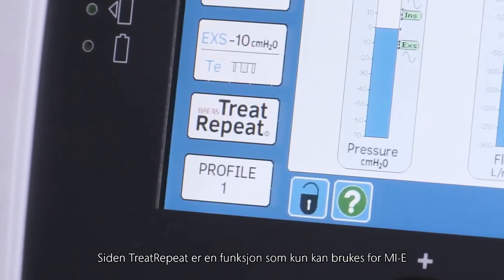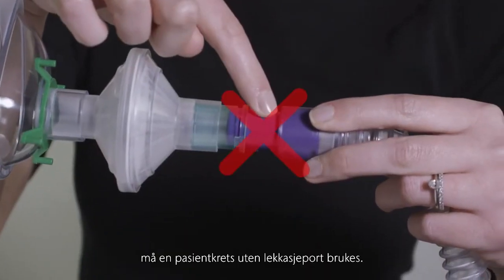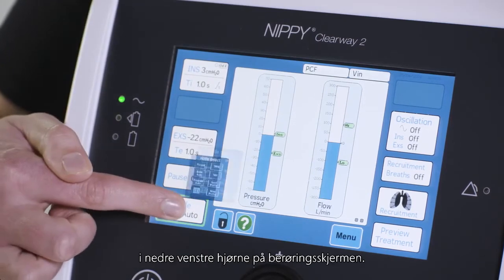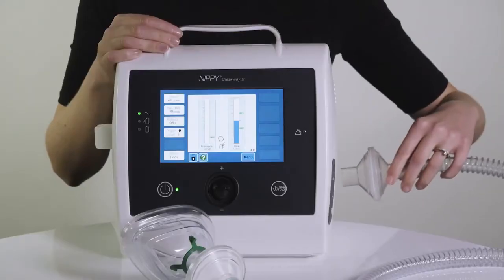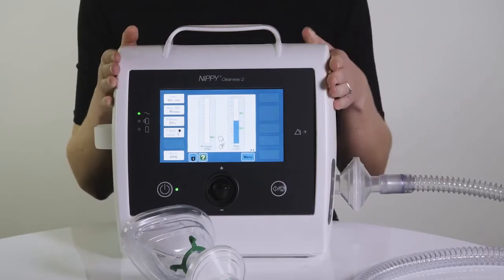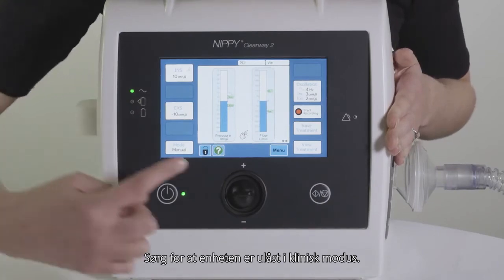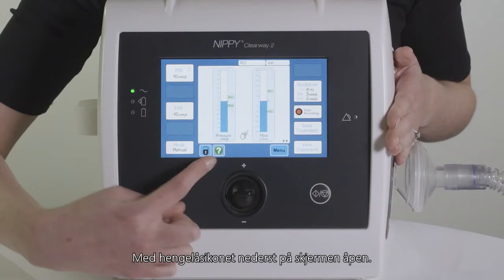As Treat Repeat is a feature which can only be used for MIE, a circuit with no leak port must be used. If not already in the manual mode, press the mode button in the bottom left corner of the touch screen, then select manual. Connect the circuit and interface to the Clearway 2 and the patient, and set insufflation and exufflation pressures as required. Ensure the device is unlocked in clinical mode, with the padlock icon at the bottom of the screen open.